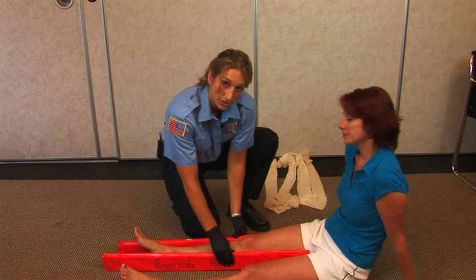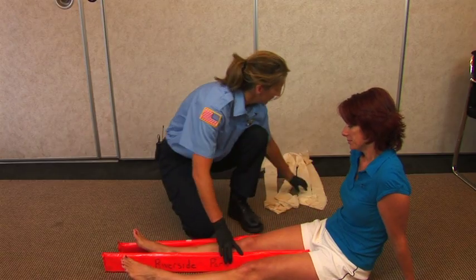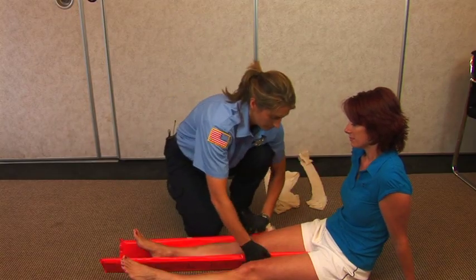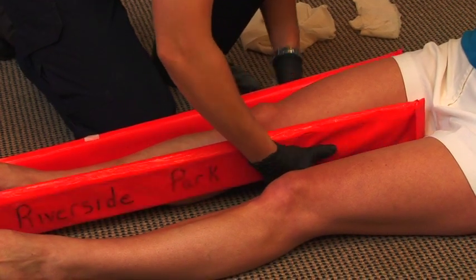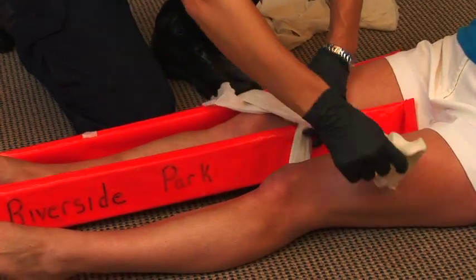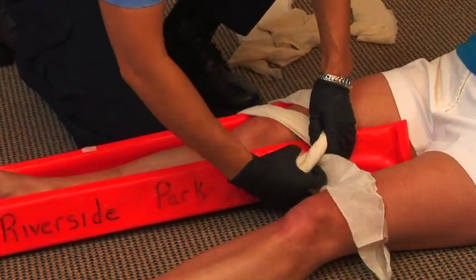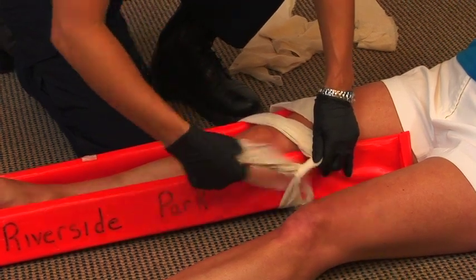Apply the soft part of the splint to the inner leg and the outer leg. You can use tape — in this case I'm going to use cravats. Wrap above the joint, and when tying your knot, make sure that you tie the knot on the rigid side of the splint.